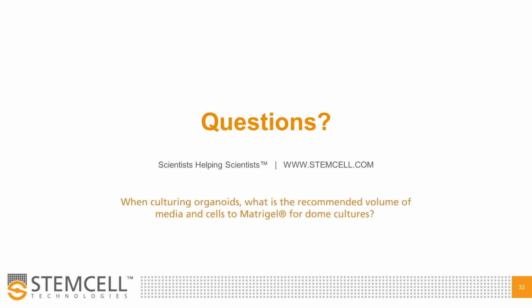Yeah, so usually the medium volume needs to be adjusted to the well format. The recommendation that we have is that for a 30 microliter Matrigel dome seeded into a 24 well plate, we usually use 750 microliters of expansion medium, and we change the medium every 2 to 3 days. That allows scientists to have weekends without medium changes once the medium is changed on a Friday. And that usually allows for 3 media changes before organoids are passaged.